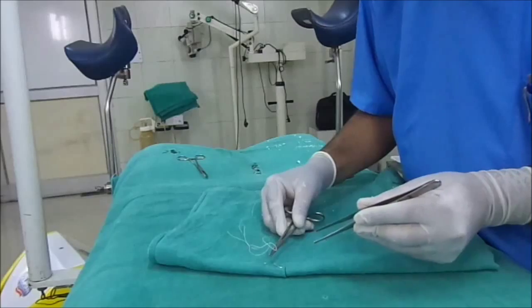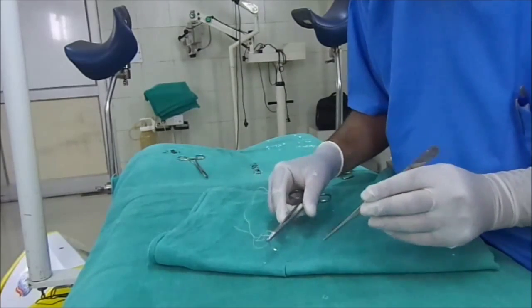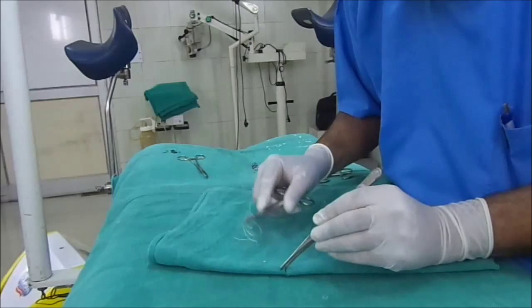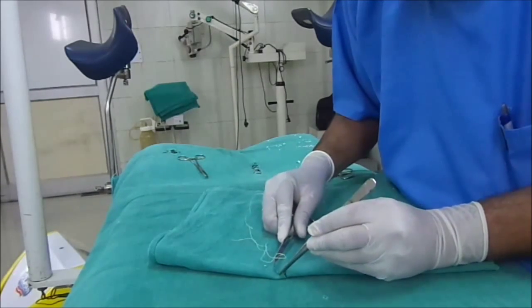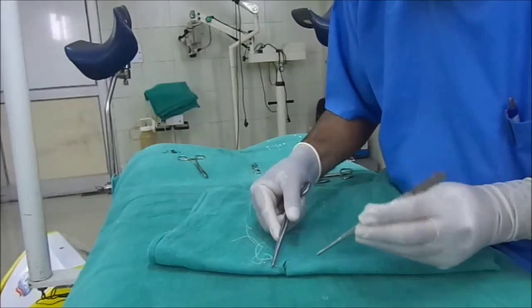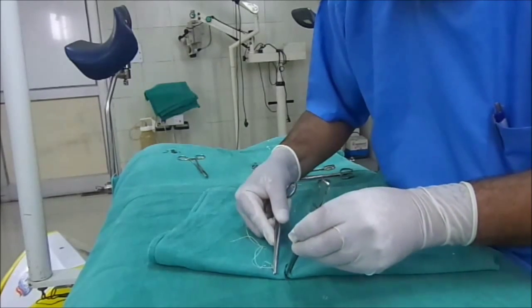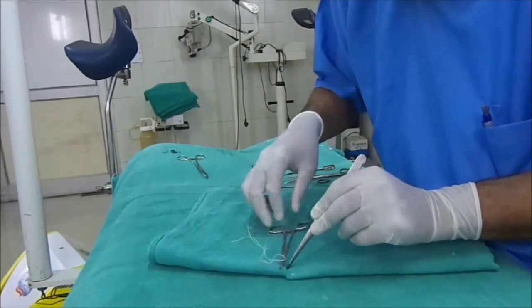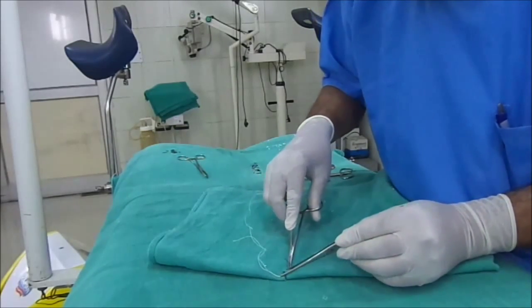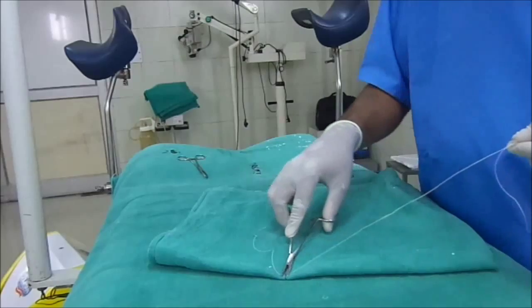If we don't follow this rule, there may be inversion of the skin edges. Moreover, the depth on both sides should be the same. So first hold the margin of the skin and then pierce the needle — just like that. Then hold the needle and it should come out at equal distance. While coming out, the needle tissue should be supported — gradually the tissue should be supported.